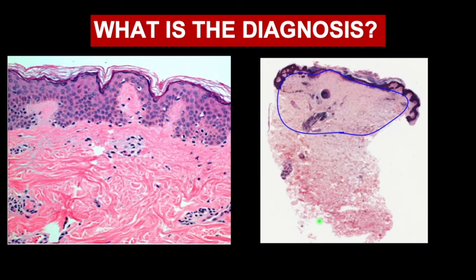If we look at this area, we see basically the dermis looks a little bit paler, or the pink texture looks different than the normal texture that we see in the dermis. The other thing you notice here also is the blood vessels appear dropped, or atrophic.